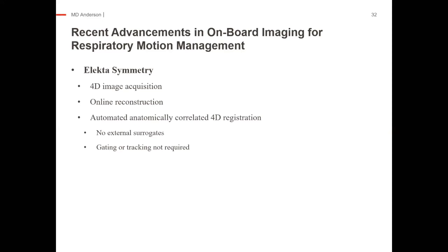You're in large part going to be restricted just by your actual imager. So you should be doing a full scan acquisition, so it's going to be a half fan. So that'll be your 360 degree rotation. We typically do like a low dose thorax protocol that Varian has. I can't remember, it's like 2.5 millimeter slice thickness, I believe. There's not really much that we can do. It's kind of a lockdown system just based on your detector panel.